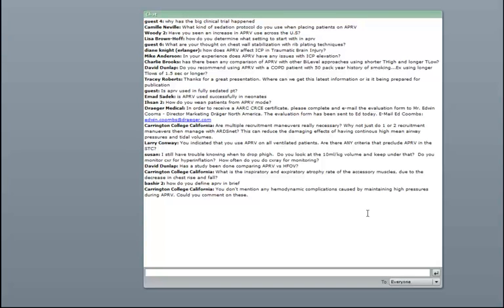flow. If you increase the T-low, you will probably end up de-recruiting the lung, especially if you use a P-low of 0. Remember that if you use a P-low of 0, you can actually get to 0, and that's why we actually use the flow pattern to tell us that we are not getting to 0.